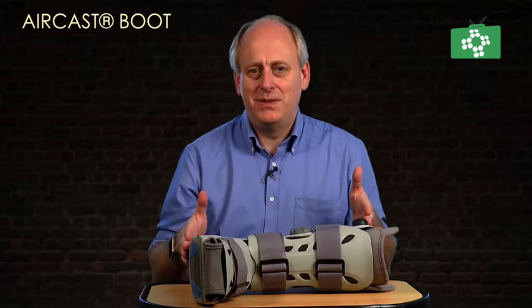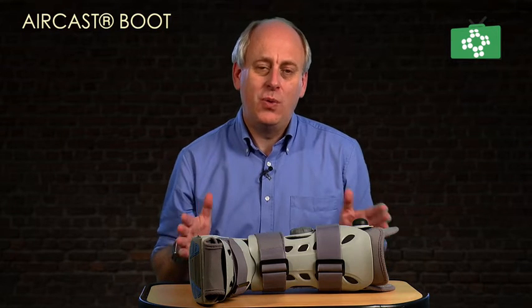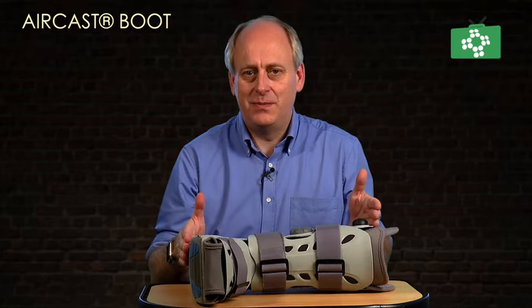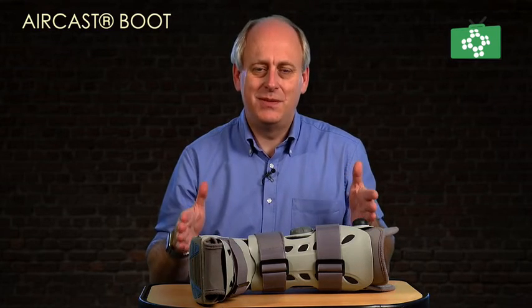This is the Aircast boot. This is the sort of boot that we put on after someone's come out of plaster, or maybe they've got an injury which doesn't actually need full plaster, but this will immobilise their ankle. Personally I've tried other boots, but this by far is the best one, the most comfortable one, and gives the most support.